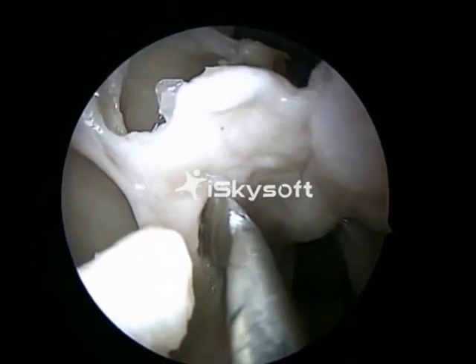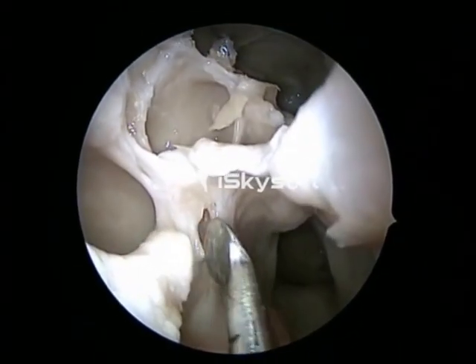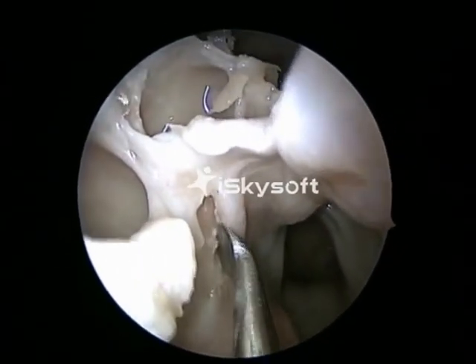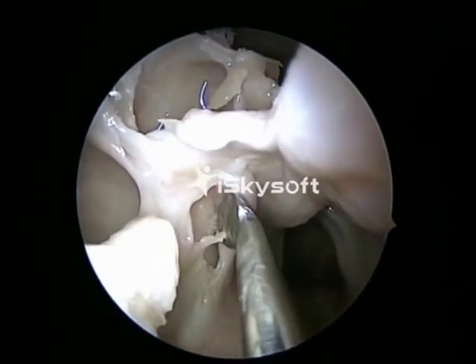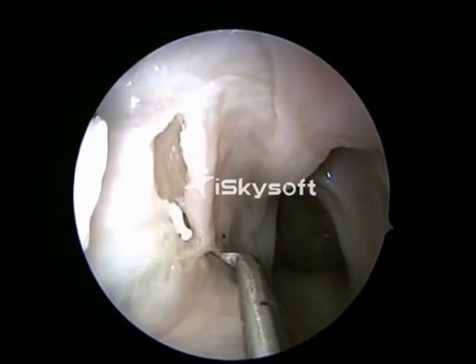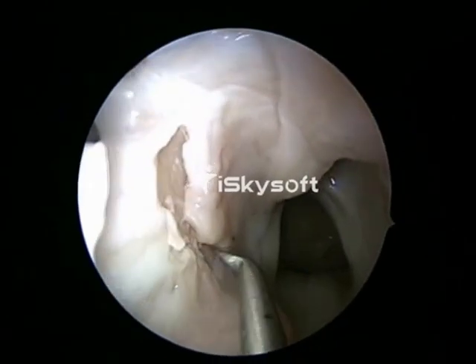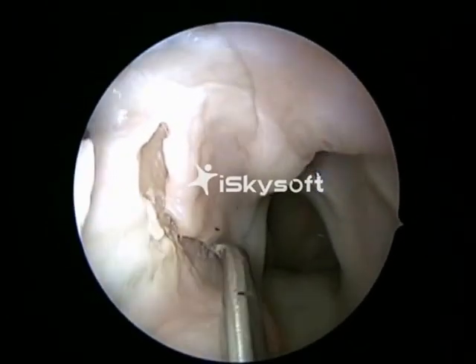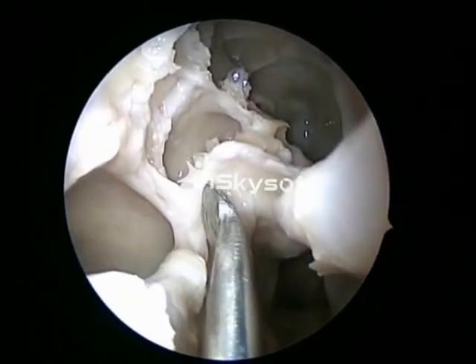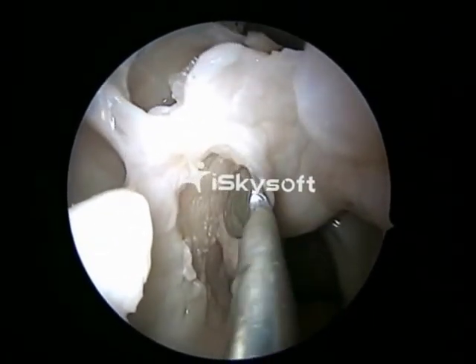The next exercise would be a sphenopalatine artery ligation, and for that we make two incisions. One, a vertical incision, which is just posterior to the posterior aspect of the middle meatal antrostomy. The posterior incision is being given, a vertical incision, and that's the horizontal incision made above the superior aspect of the inferior turbinate at its posterior end. And then a subperiosteal plane is created and it is dissected to expose the crista ethmoidale.